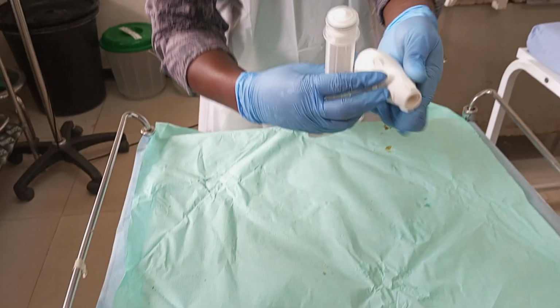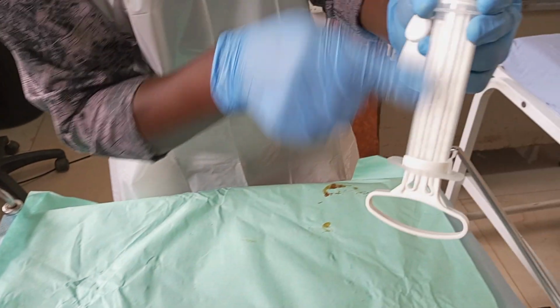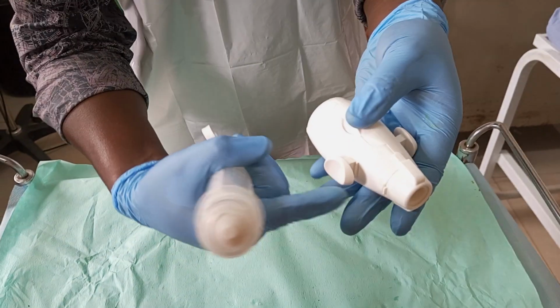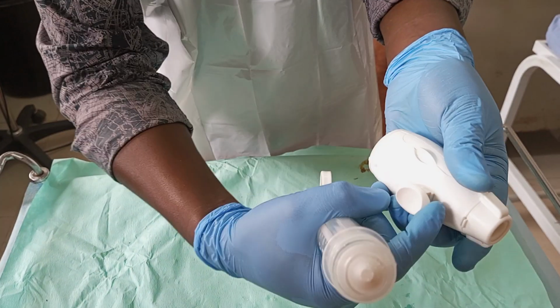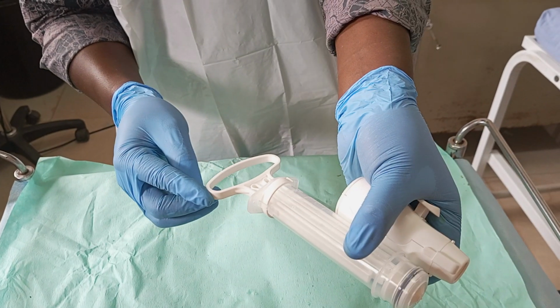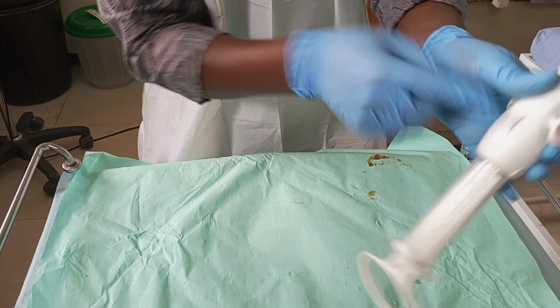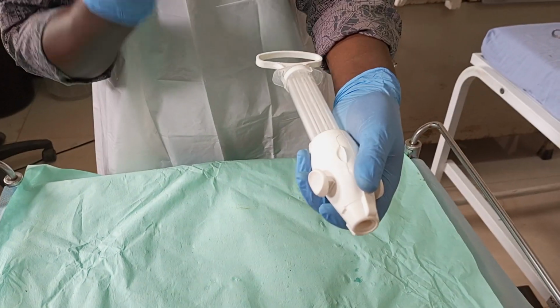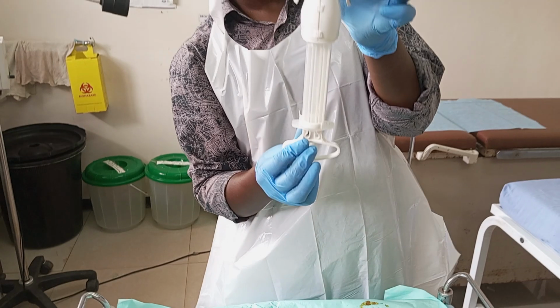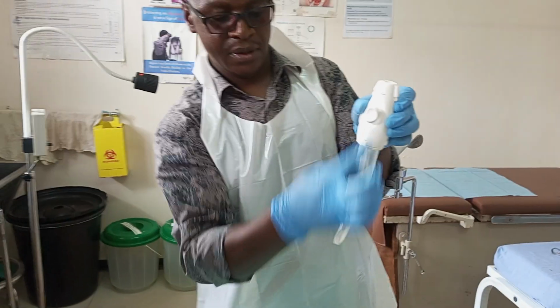Next, make sure this structure faces you and the readings on the cylinder face you. And make sure that the alignment of the protruding structures, the buttons, the collar, and the wings of the plunger are corresponding and aligned nicely. This one facing you, readings facing you, the alignment should be nicely done. Okay, they should correspond.